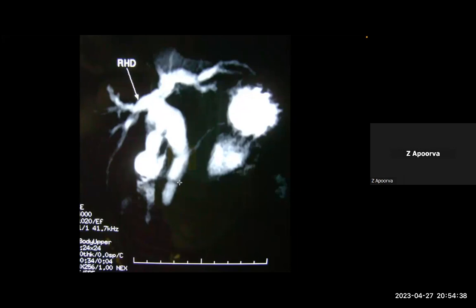So it's a fusiform variety. Okay, what else are you seeing? Yes, it's fusiform. This is a gallbladder. What else are you seeing? Or what else will you look for? What is this? What are these two blobs? Is that the stomach and duodenum? Yeah, it is. You can see the rugae, etc. What else are you seeing? Very prominently, you can see it. You should have told me about that.